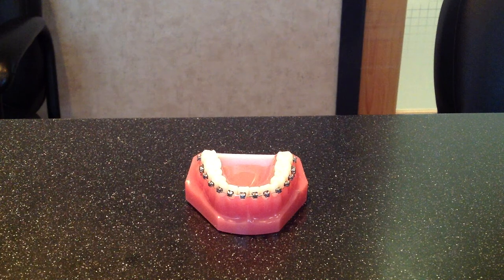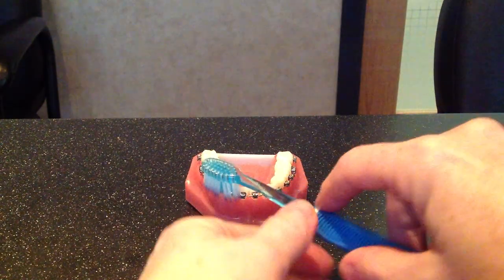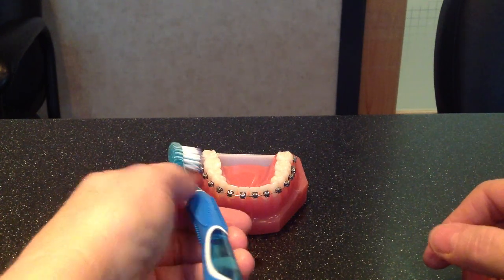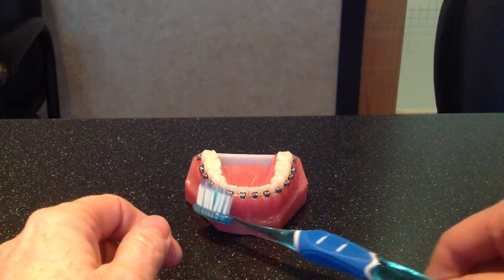To brush your braces is not hard — it's actually quite easy. You just take a toothbrush, use just a little bit of water, and you're going to force your bristles above your braces along this way. You can see how it forces the bristles right down into the braces. Then you're going to turn 180 degrees and go all the way along like this.